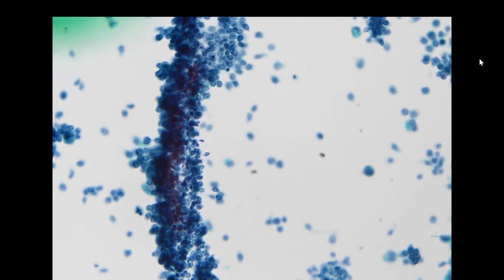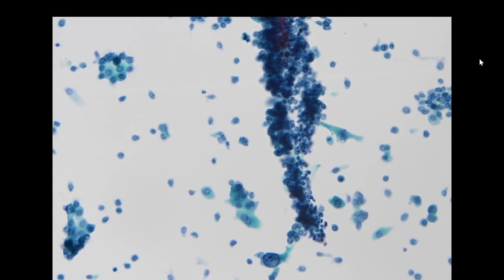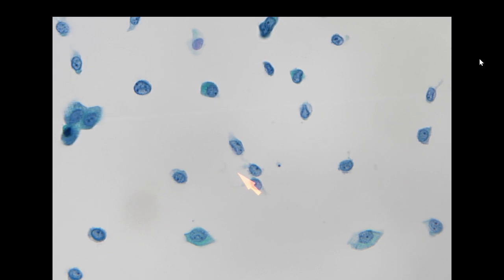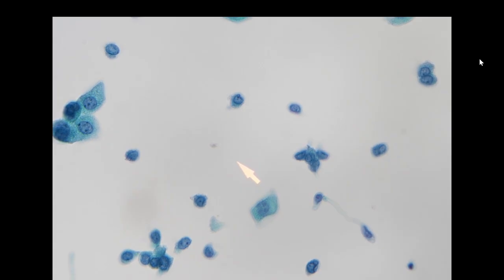Then we go to the middle power. Here in the background, we can appreciate a lot of relatively bland looking cells, but the NC ratio is slightly increased, and a lot of cells have an elongation or stellate type of feature. But the nuclear chromatin pattern lacks hyperchromasia. So the NC ratio is not as high as the cell that we saw earlier. It's about 0.7. Here it is between 0.5 to 0.7.